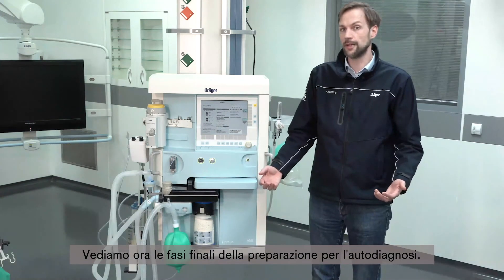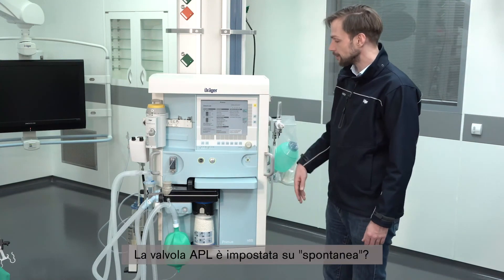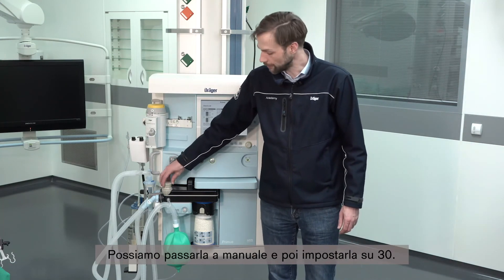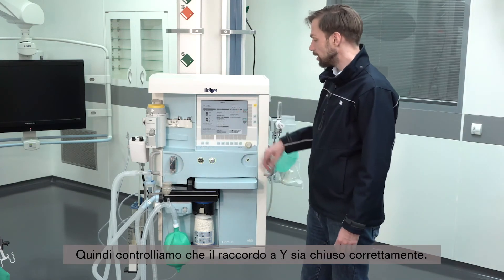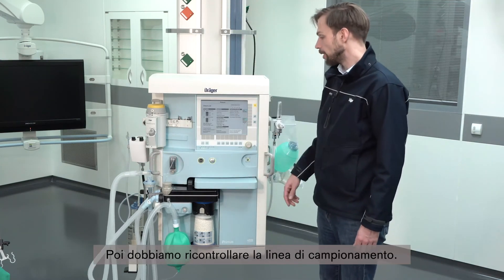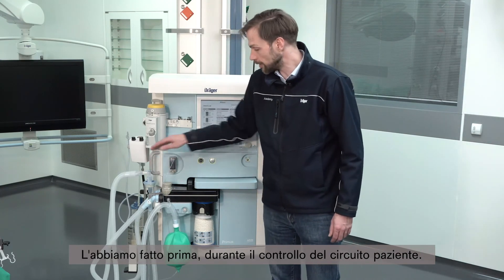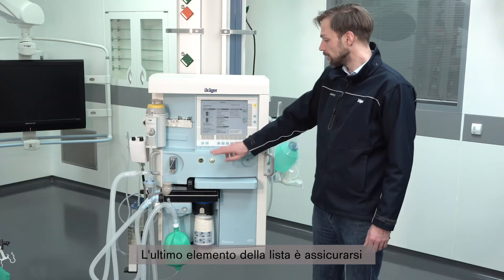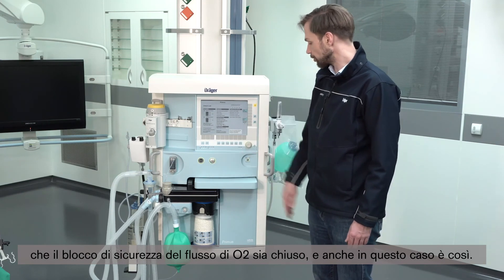Now the final steps of the preparation for the self-test. The APL valve — if it is set to spontaneous, we put it into manual range and then set it to 30. Next, check that the white piece is fitted correctly. Then we check the sample line again, as we did during the breathing circuit check. Finally, make sure that the safety O2 flow control is closed — which is also the case here.